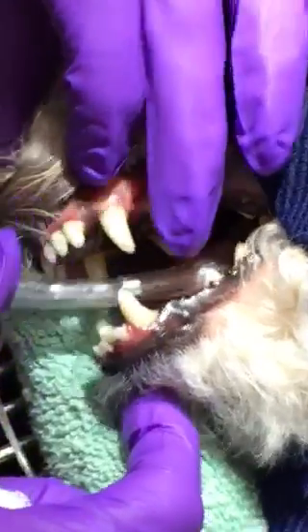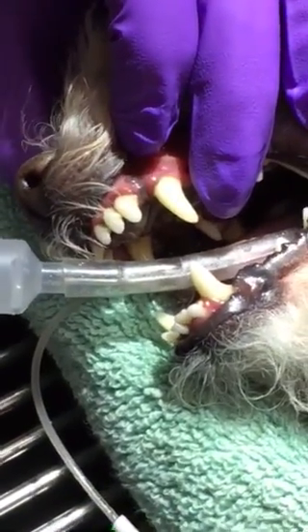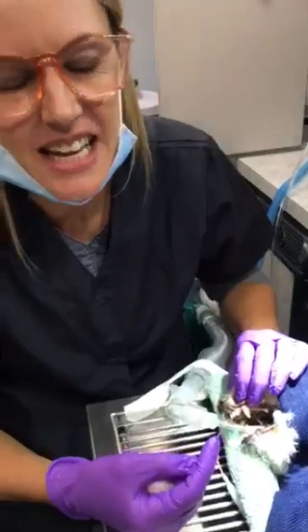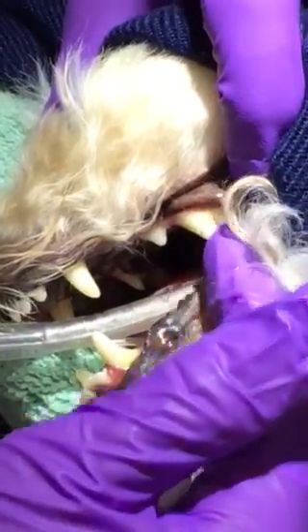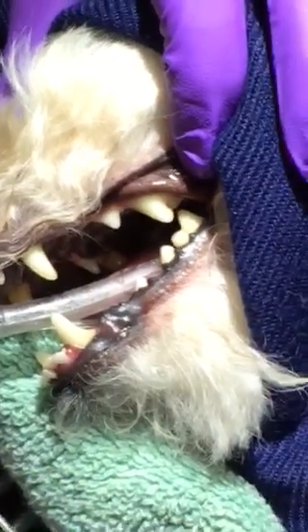She has very loose incisor teeth. Dental extractions can vary tremendously between animals and specific teeth. For example, a little tiny loose incisor like this can take 30 seconds to pull out, whereas if we go into the back, these bigger molars — depending on their level of dental disease and periodontal disease at the root — can take anywhere between 20 and 30 minutes to pull and stitch up.